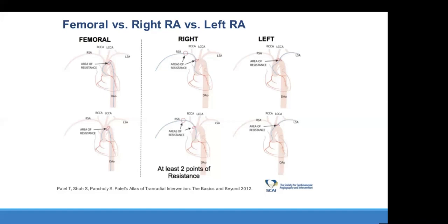If you think you're over torquing, stop, take your time, and allow the catheter to transmit your torque. Some people don't know that. I see fellows, especially with the RCA, which is more challenging to intubate compared to the left, which is easier, they torque and they want an immediate response. There is a time delay. Allow the torque to transmit from the shaft of the catheter to the tip. It will take a few seconds, so allow it to shift, not immediately when you turn. If you don't get an instant turn, you think there is a problem, so you turn more, and then you overshoot or you kink. So allow time for the transmission of torque across.